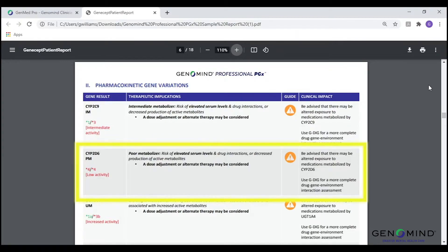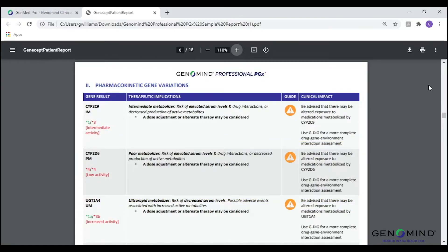Let's discuss CYP2D6 as an example of this portion of our report. We can see that based on the patient's genotype, this patient would be considered a poor metabolizer. Poor metabolizer status leads to a risk of elevated serum levels or decreased production of active metabolites for medications that are metabolized by this enzyme. For more information on how to assess the impact of pharmacokinetic variants on medications, please see our video on GenMedPro, our smarter precision gene-drug interaction software.